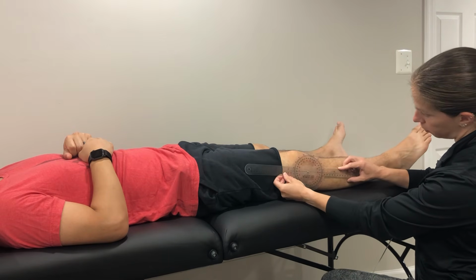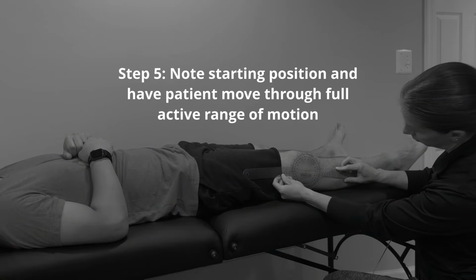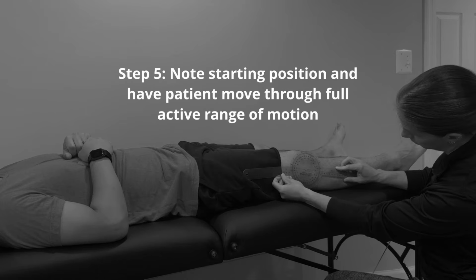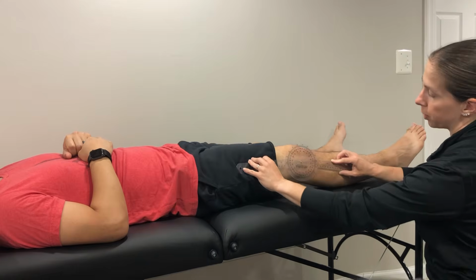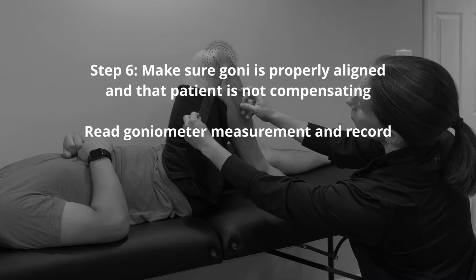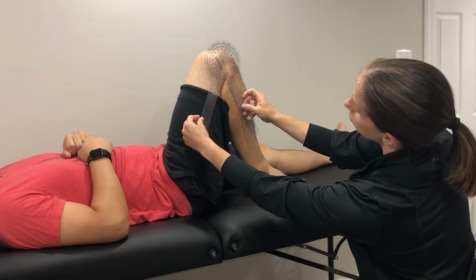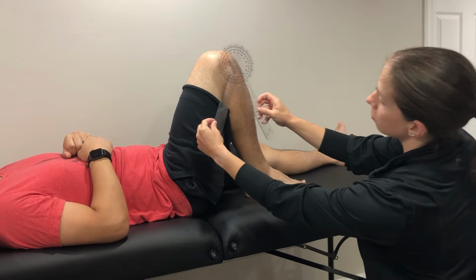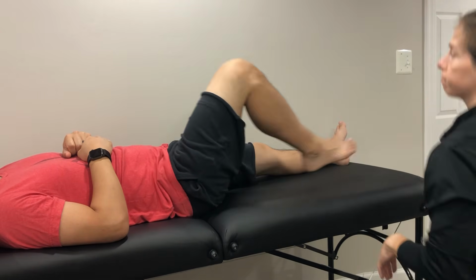With the goniometer lined up, you can note the starting position, and then your patient may move through active range of motion. You should encourage the patient to move through as much active range of motion as possible without pain. When the patient has reached their limit, you want to make sure the goniometer is still properly aligned and record your measurement. When documenting your measurement, you want to be sure to include what joint was measured, which side of the body it was, and whether the motion was active or passive.